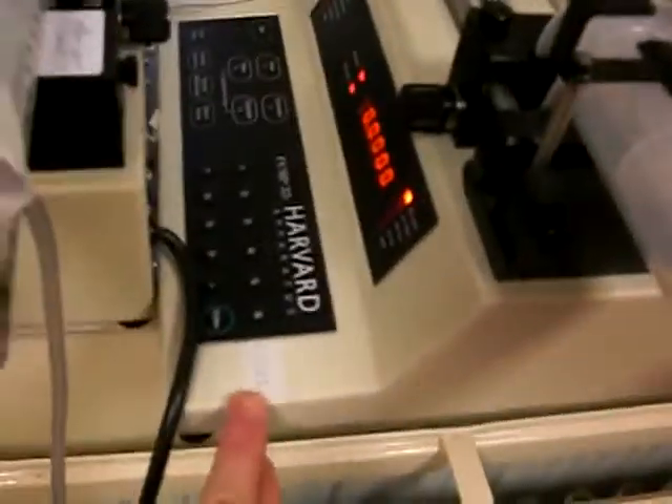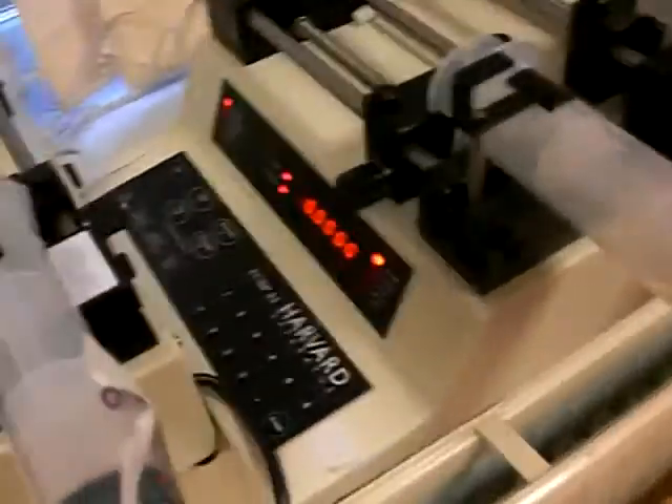The first pump is pump 00, indicated here. The second pump is 01, indicated here. And this pump is 02, indicated here.